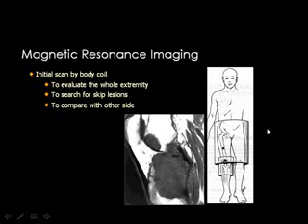Then, how to perform the MRI for a limb or an area which contains a suspected bone tumor. Number one, if the tumor is in the lower limb, like most of the tumors, you should scan the whole limb to look for skip lesions in some cases.